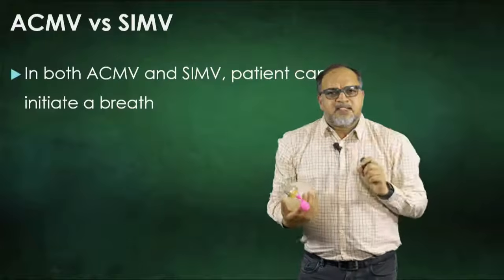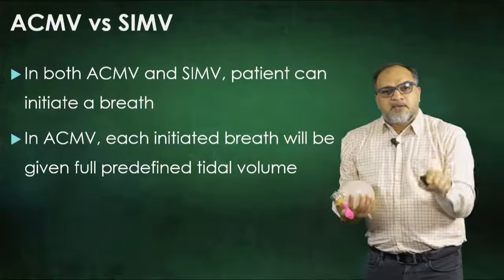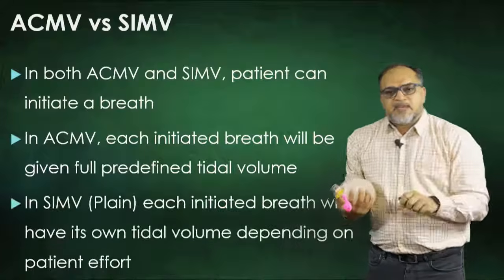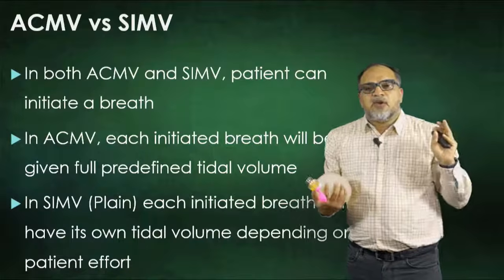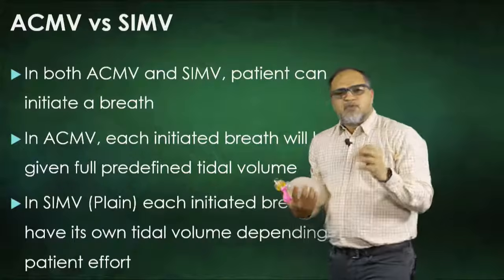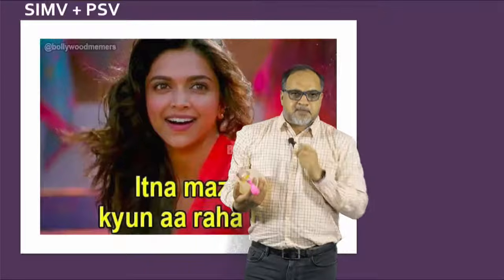In both ACMV and SIMV, the patient can initiate a breath. In ACMV, each initiated breath will be given the full predefined tidal volume. In plain SIMV, each initiated breath will have its own tidal volume depending on the patient's effort. The ventilator will not support it. Then this plain SIMV mode was also disregarded. Nowadays they don't use plain SIMV, they use SIMV plus pressure support.